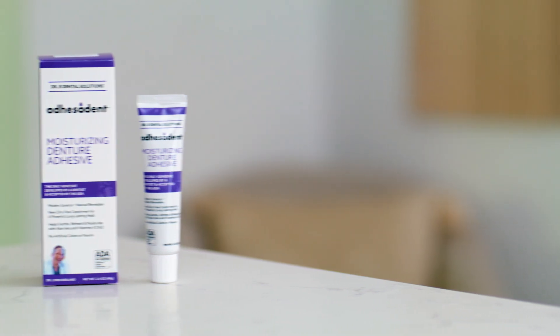First, we've got the denture adhesive. Use it as needed, but use it sparingly — it doesn't take much. A little bit goes a long way.